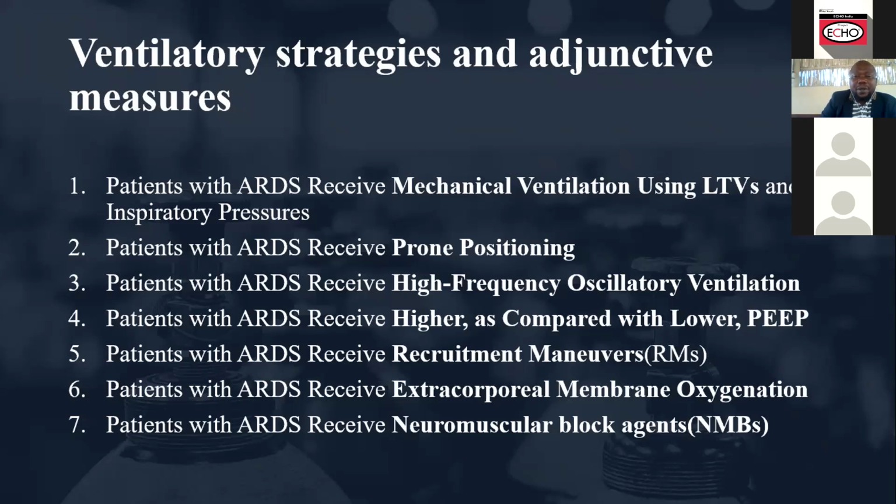The recruitment maneuver is a kind of recruiting the viable alveoli in ARDS cases so that you open them in a short time, and again maintain that recruitment, increasing the chance of gas exchange and decreasing the gas exchange distance in that status of flooding of fluids.